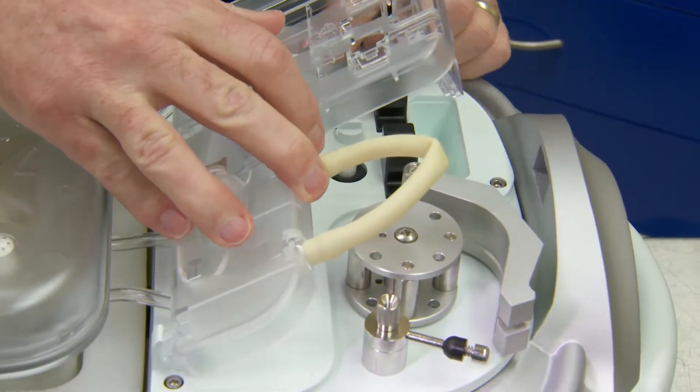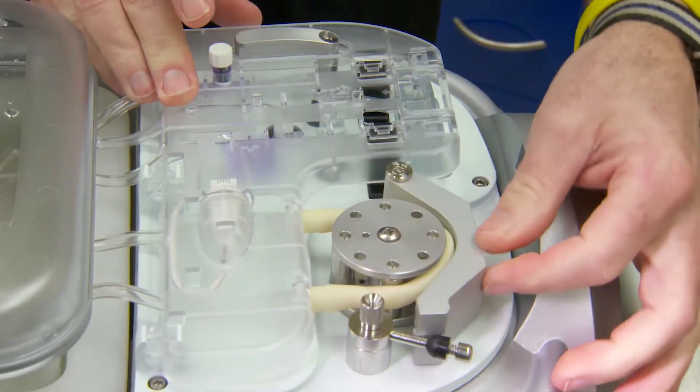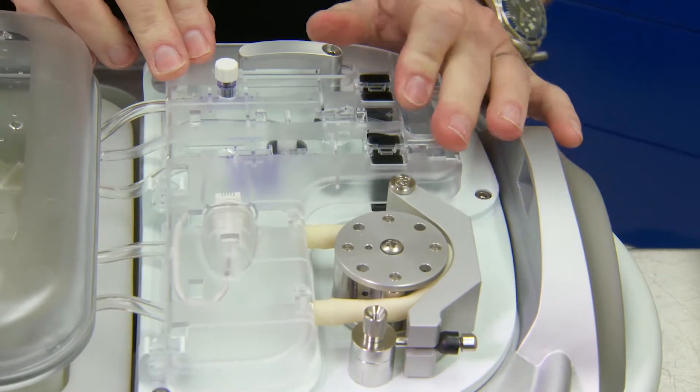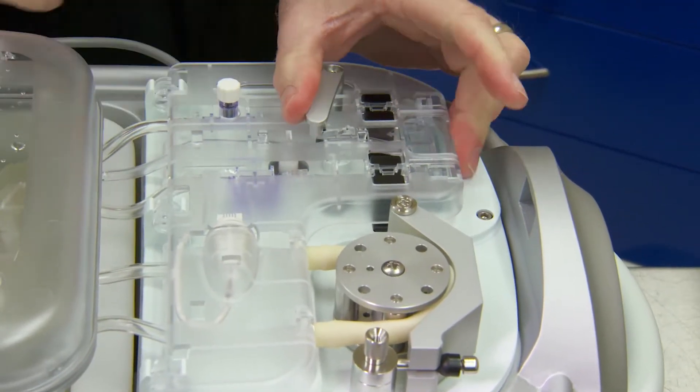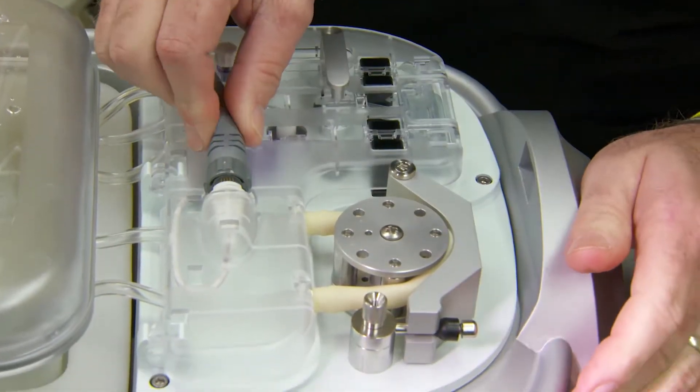The beige tubing is then placed over the pump head. The raceway is closed and the spring latch arm is locked. Apply slight pressure between the bubble detectors and close the locking arm. The pressure sensor cable is then installed.